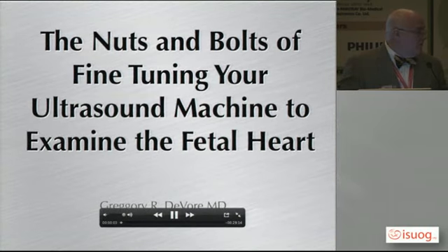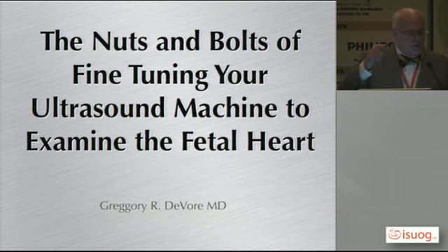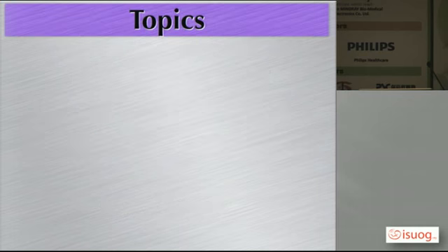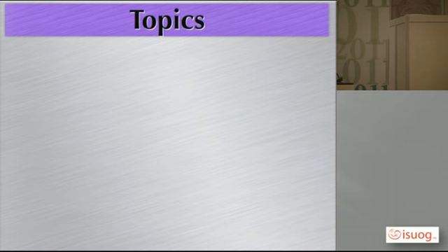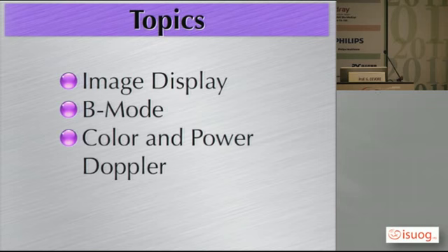Welcome. My name is Dr. Gregory DeVore. The title of this presentation is The Nuts and Bolts of Fine-Tuning Your Ultrasound Machine to Examine the Fetal Heart. This lecture will discuss methods in which the user can enhance the images obtained during the examination of the fetal heart. The topics will cover optimization of the image display, the B-mode image, and color and power Doppler images.